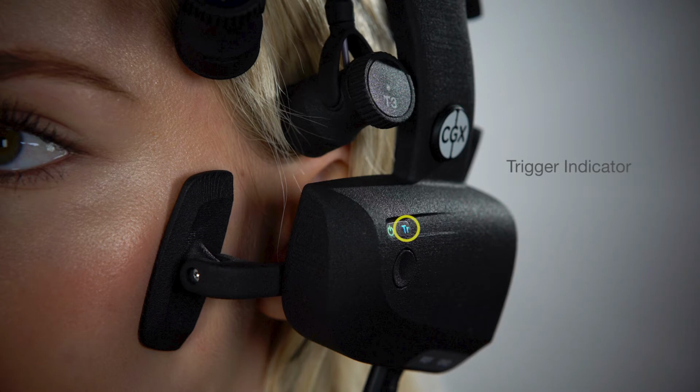This is the trigger indicator. If you're using the optional CGX wireless stim trigger, the light will be off when the trigger is out of range and blue when the trigger is in range.